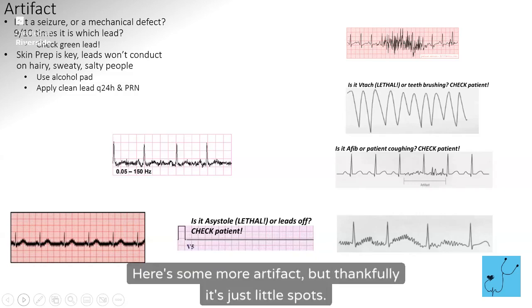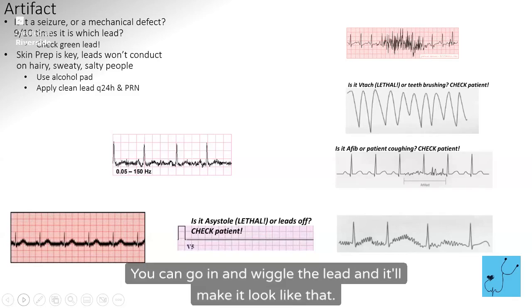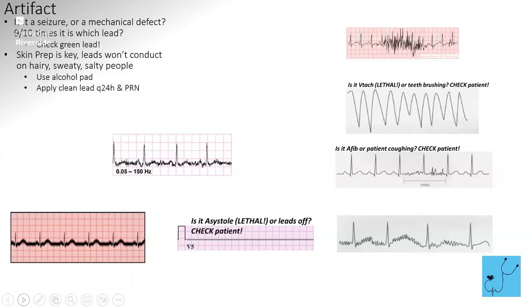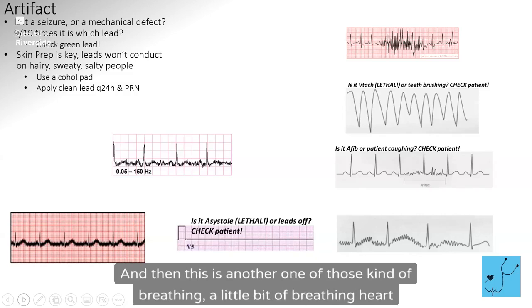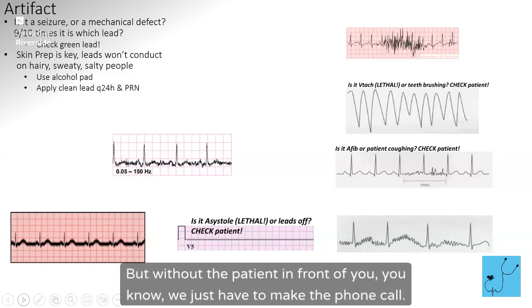Here's some more artifact, but thankfully it's just little spots. Is this VTach or is it teeth brushing? Because you can go in and wiggle the lead and it'll make it look like that. And then again, this could be coughing or movement. And this is another one, a little bit of breathing artifact. But without the patient in front of you, we just have to make the phone call.